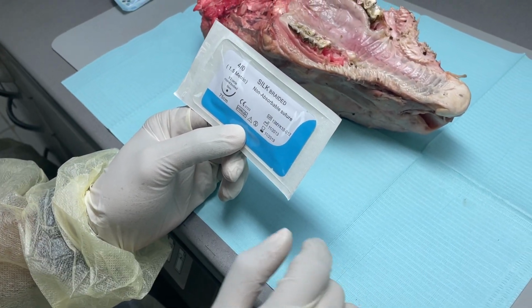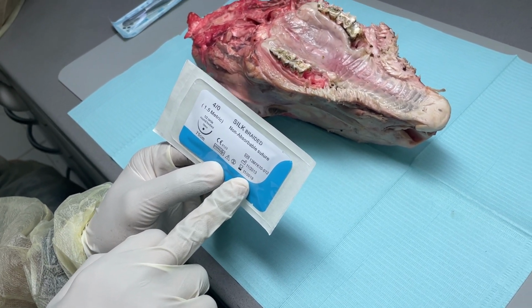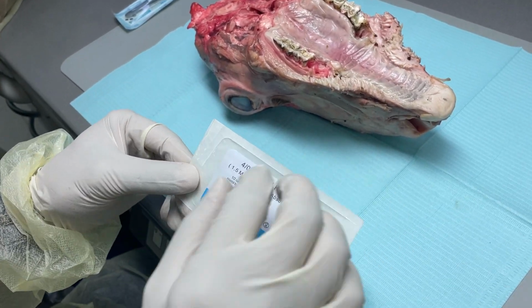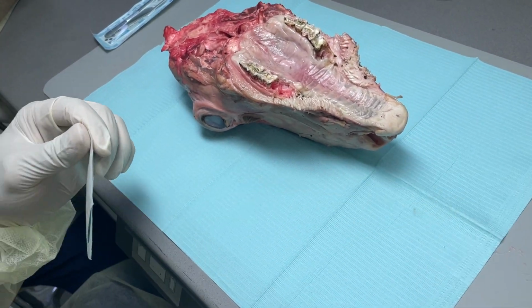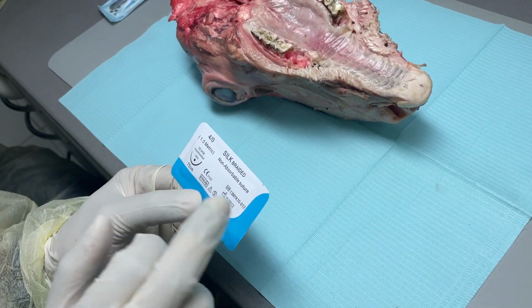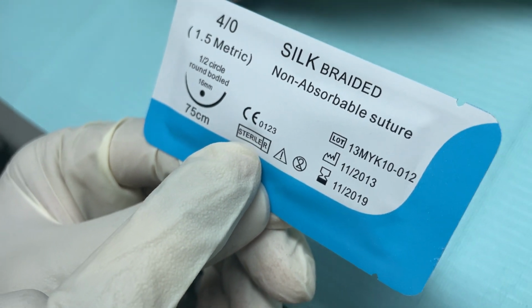This is when it is manufactured. This is the expiry date, 2019. That's expired. Yes, 7 years. No problem, this goat will not complain, so it is okay. Fine. Is it sterile or not? Yes, it is written, sterile.